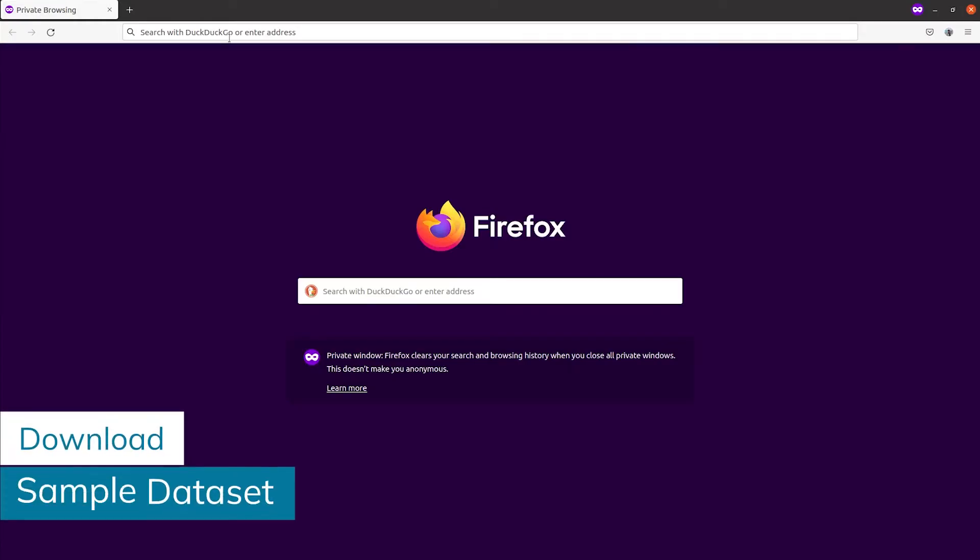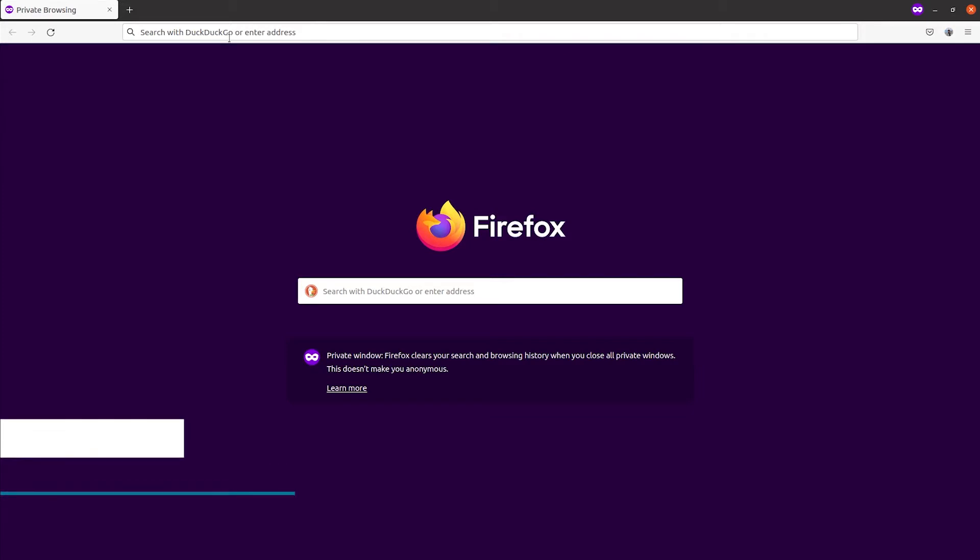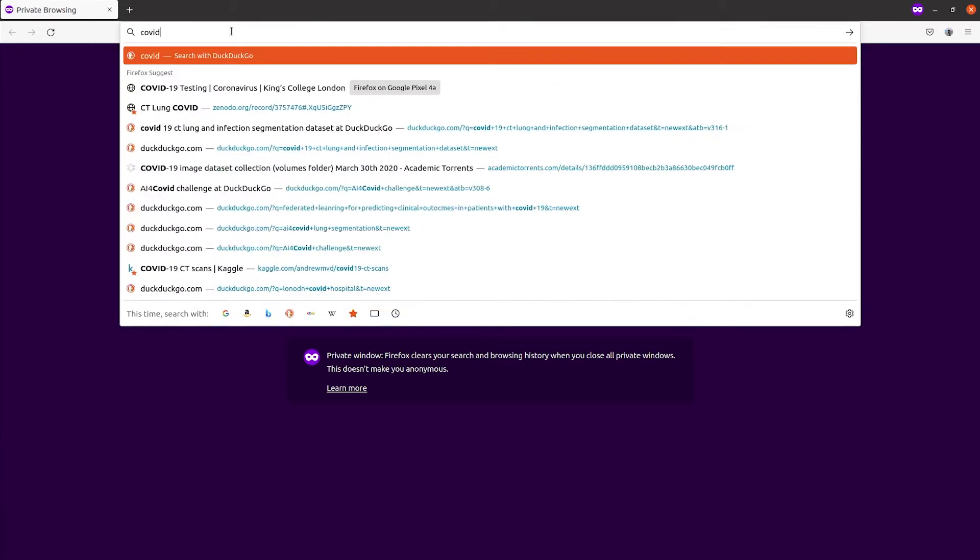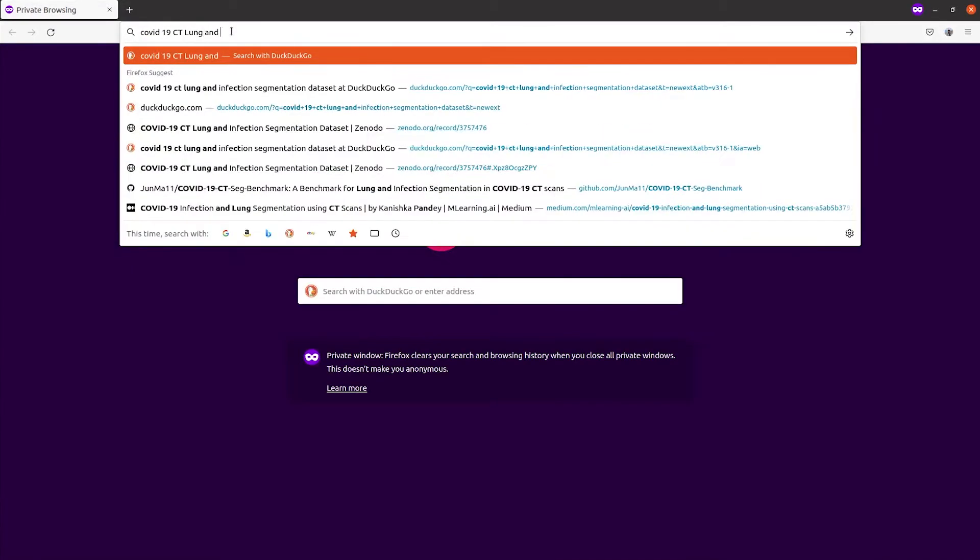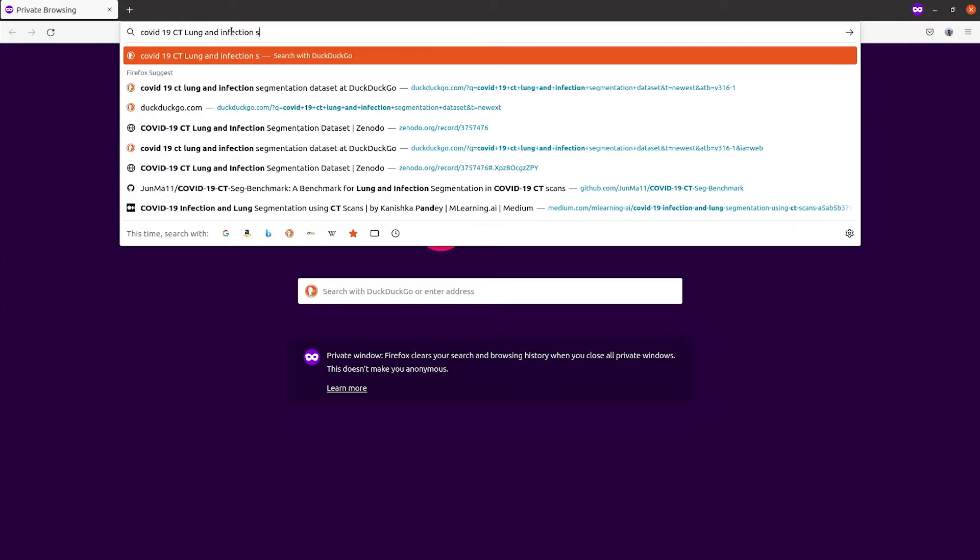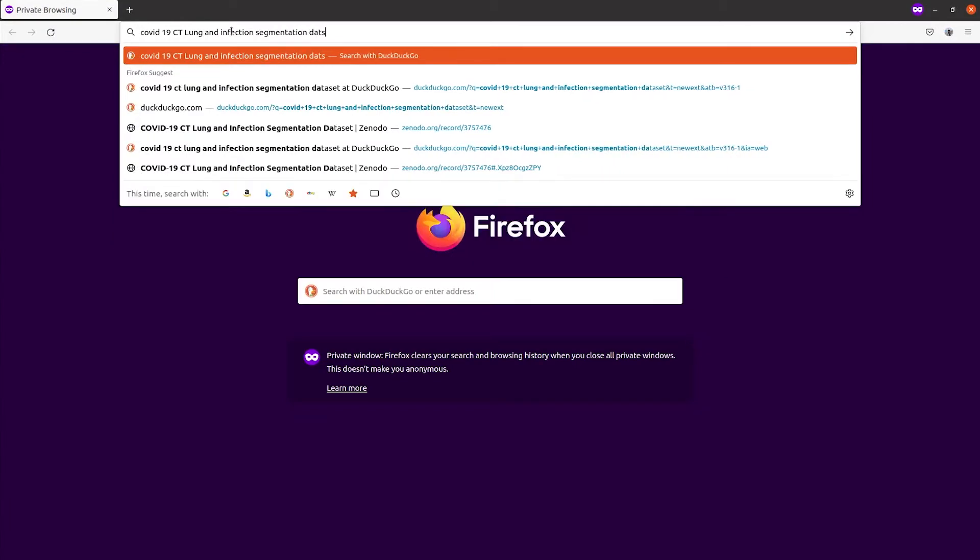The very first step is to download the data set we're using. For this video we'll use the COVID-19 CT Lung and infection segmentation data set.